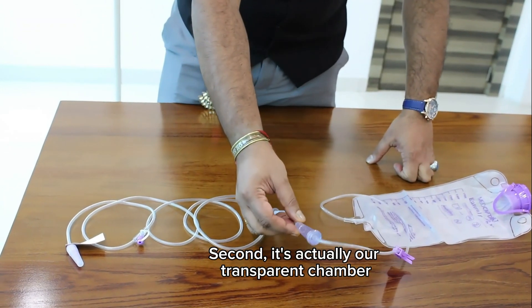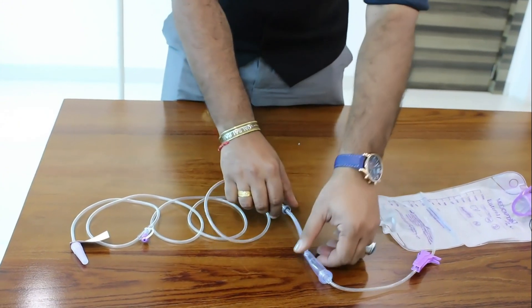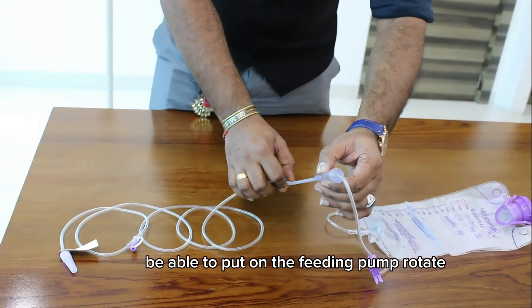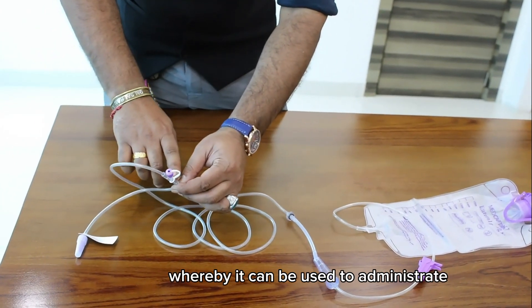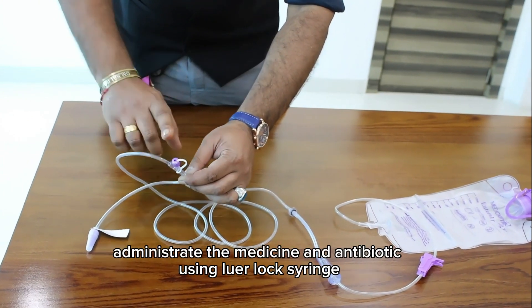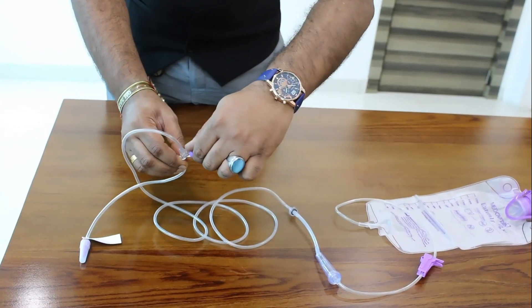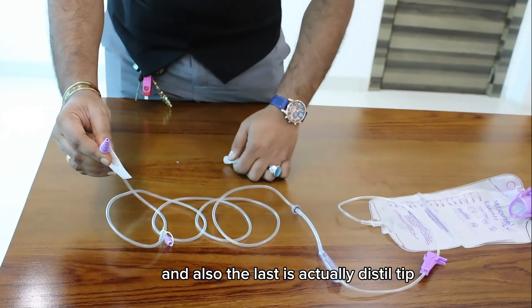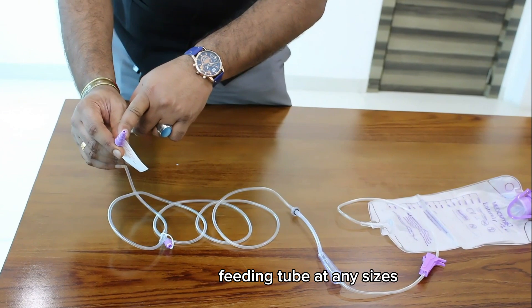Second is our transparent chamber whereby you can see the drip. Then there is the silicone tubing which you place on the feeding pump rotor. We also have a white port whereby you can administer medicine and antibiotics via the luer lock connector. Finally, the distal tip allows you to connect to any feeding tube of any size.